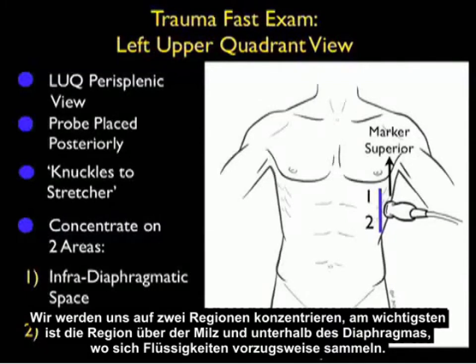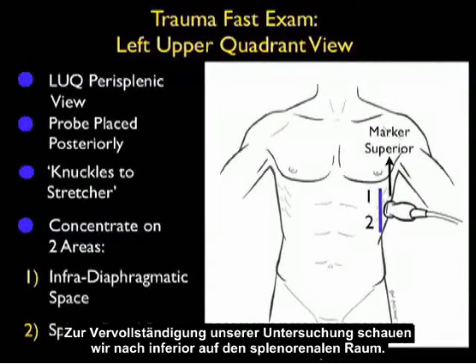We'll concentrate on two areas: most importantly, the area above the spleen and below the diaphragm where fluid will preferentially accumulate, but rounding out our exam we'll look inferior at that splenorenal space.